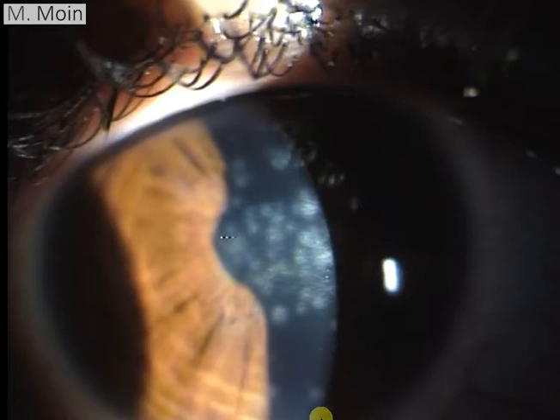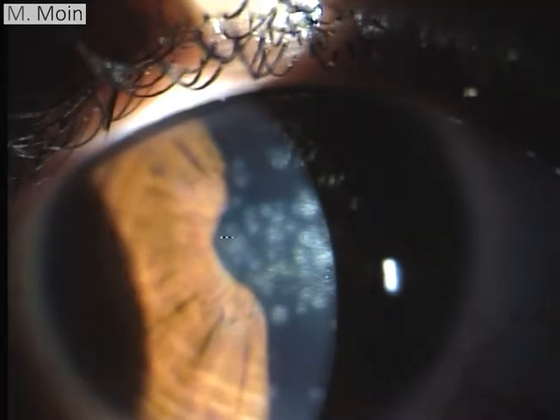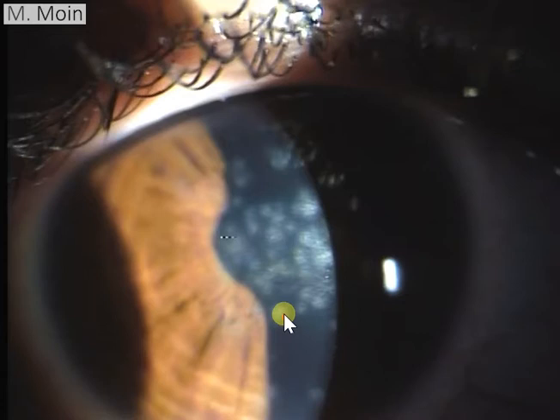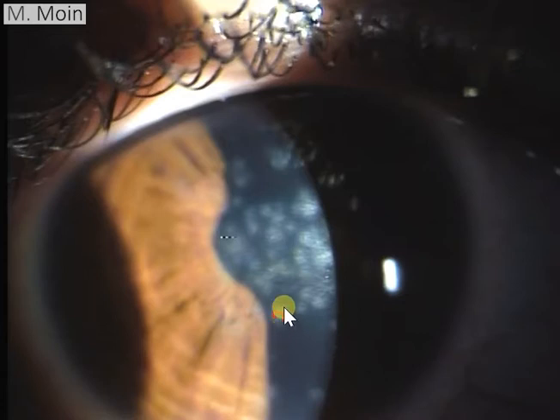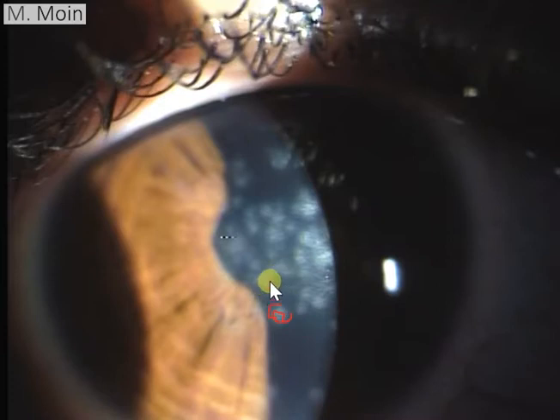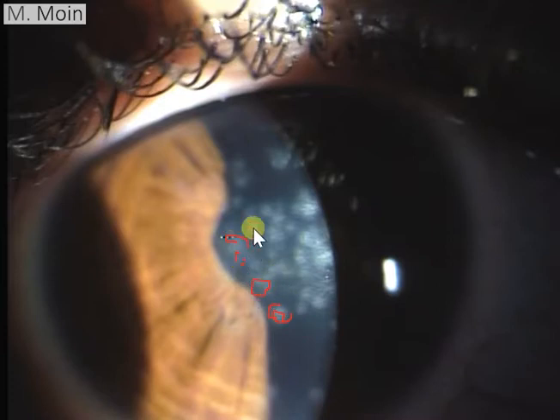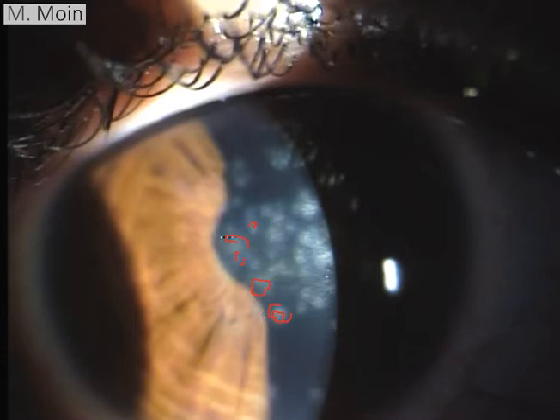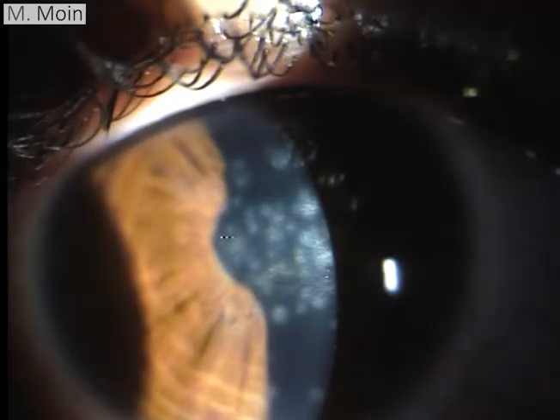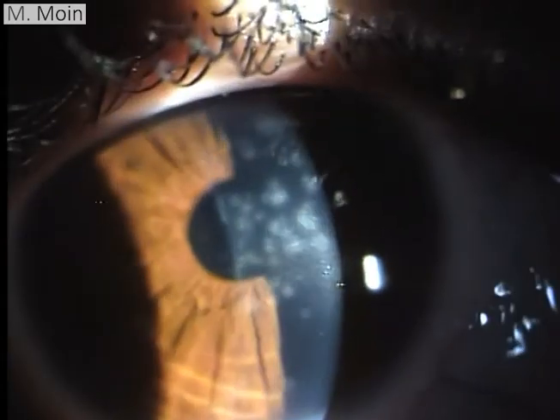Here, if you look closely, what you'll see are granular, multiple granular lesions surrounded by a slight haze around them. These are typical corneal lesions which are seen in patients post adenoviral keratoconjunctivitis.